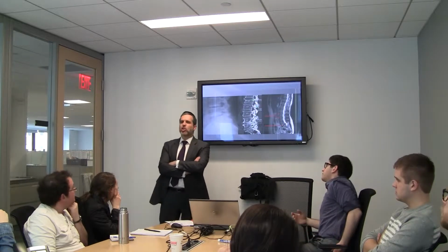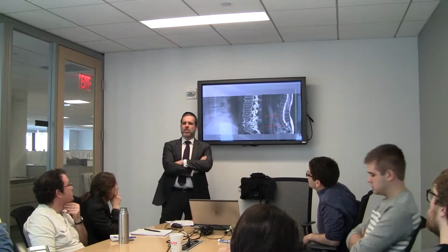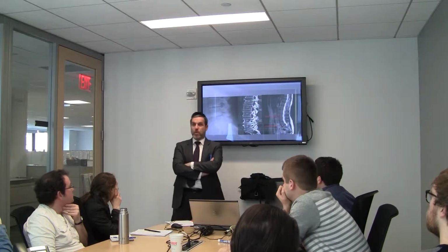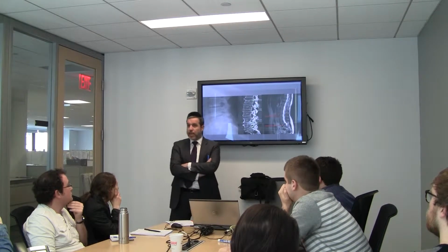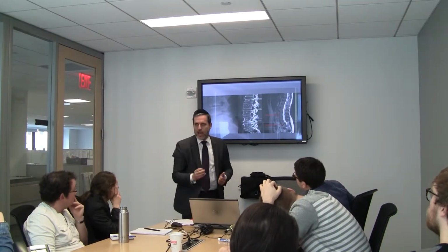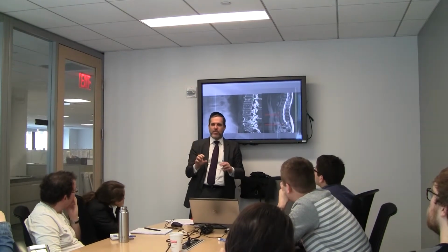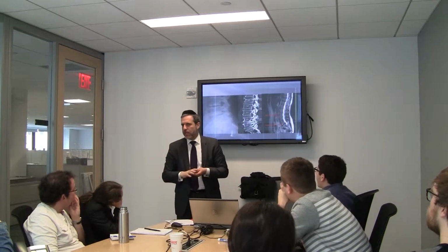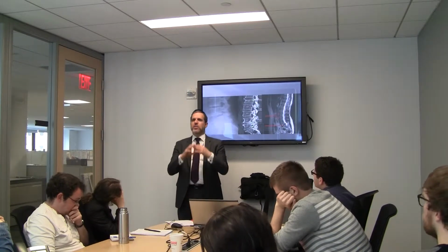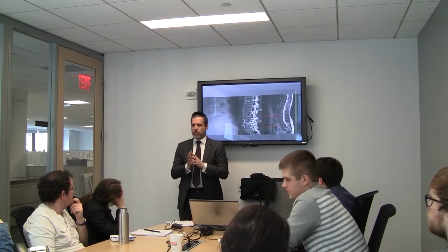Let's say you're looking for a spinal curve. The patient comes in and has a sprained back, and they look at them, they're not straight. What's a better study, an AP X-ray or an AP MRI? AP X-ray, because that X-ray is actually showing you the curve in real time, versus the coronal shot on the MRI we saw. I saw a lot of detail, a lot of different things, but it wasn't the bones as they really are. No question, MRI is a better overall study for most applications, but it's not always the best for everything.